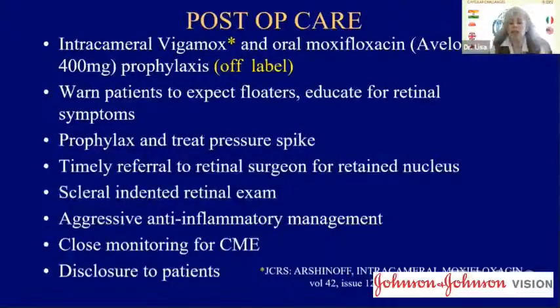We want to prophylax and treat pressure spikes. Better to leave more OVD alone in the eye, especially if it's not Healon 5, which I would never use in a complicated situation, and prophylax, than to be aggressive, taking it out and allow vitreous to come forward again.